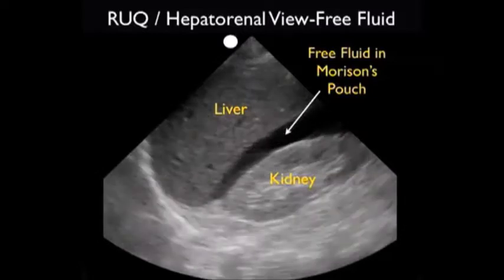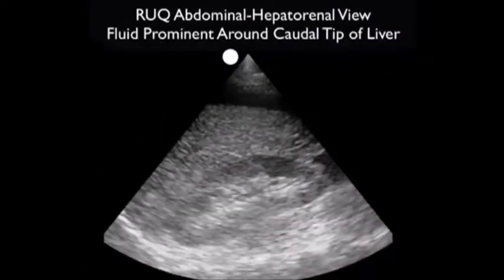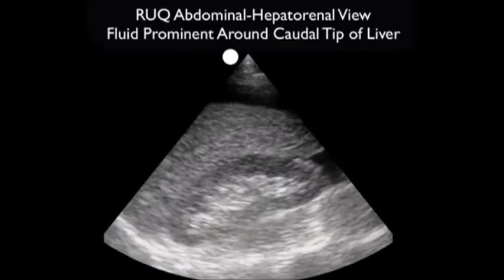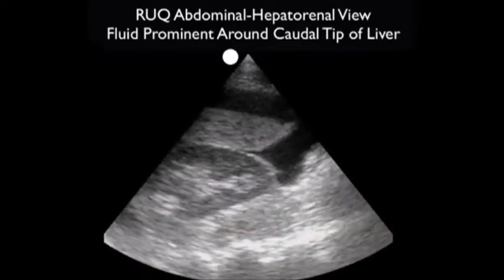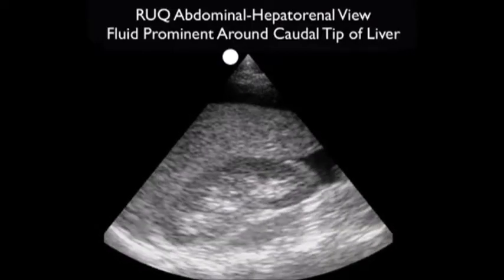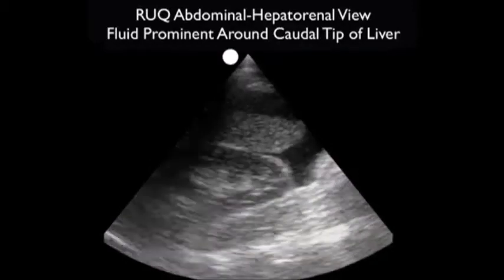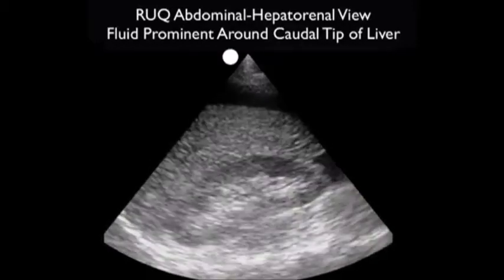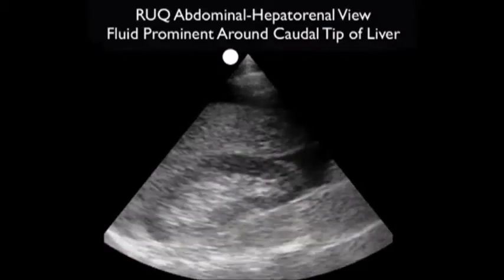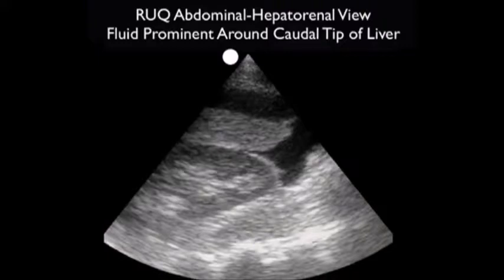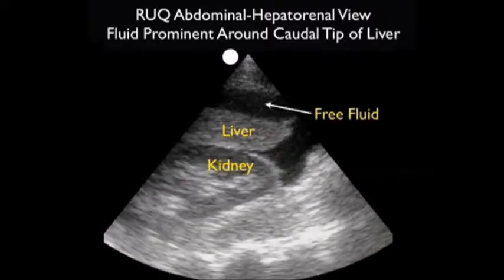Notice that it layers out in between that liver and kidney. To emphasize that a complete right upper quadrant view includes looking at the caudal tip of the liver, let's examine this video clip from another trauma patient. If we look at the hepatorenal interface, we fail to see any fluid, but as we move the probe inferiorly, we see that the caudal tip of the liver is well outlined by fluid — both anterior and posterior to the caudal tip — making this a very important area to examine.